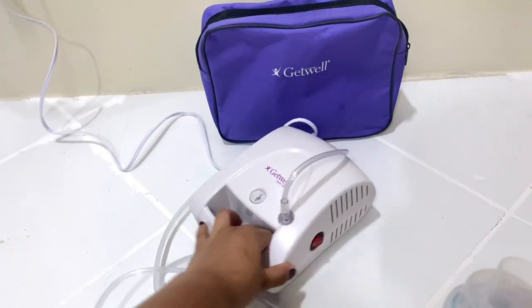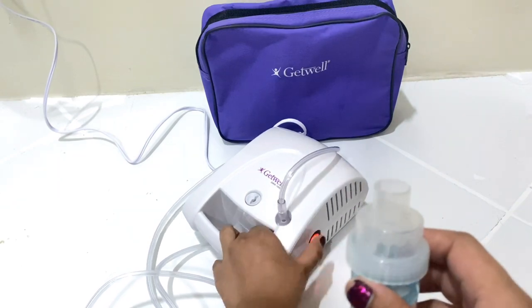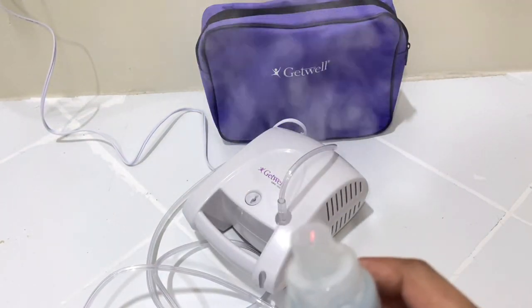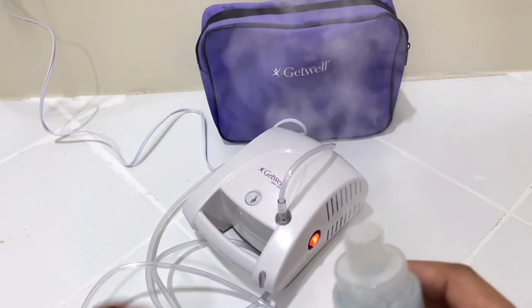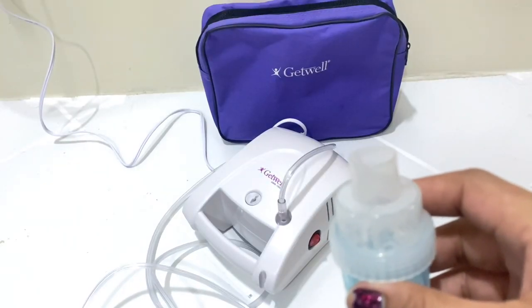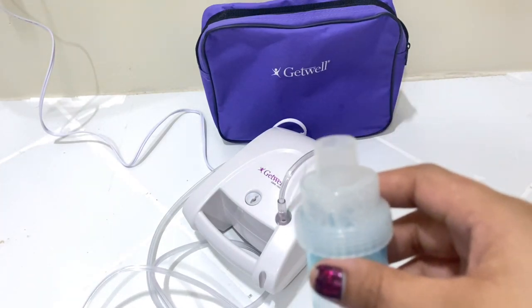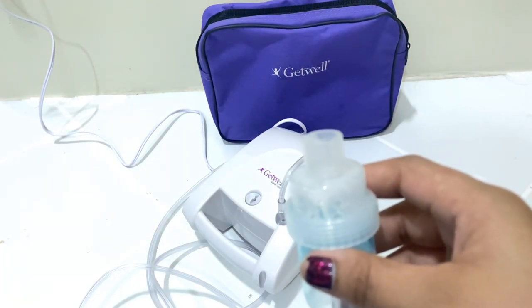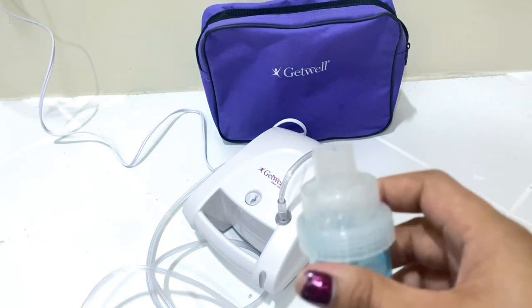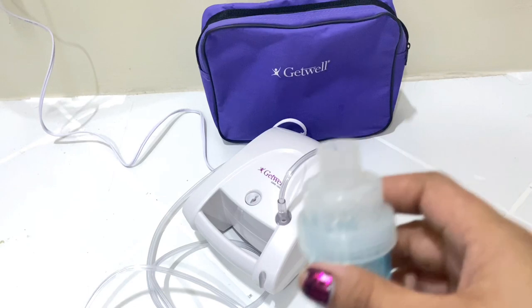So, turn it on. So, napapansin nyo na maingay yung machine natin. Pero may mga machine na hindi siya maingay. Pero matagal kang matapos na mag-nebulize. Yung amin maingay. Pero madali kang matapos naman.